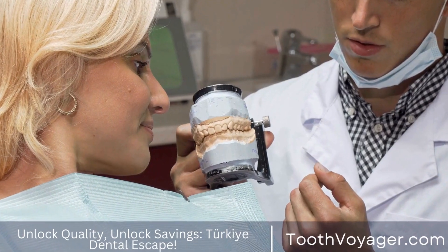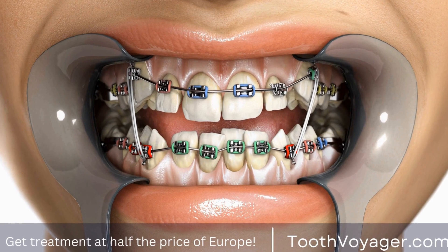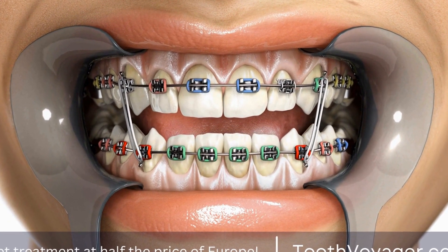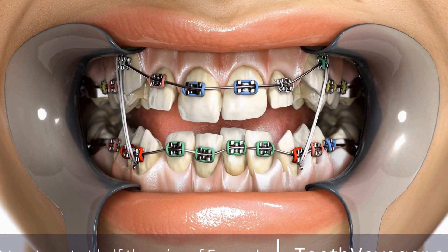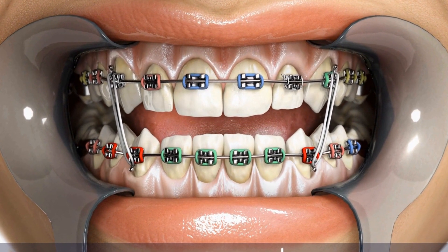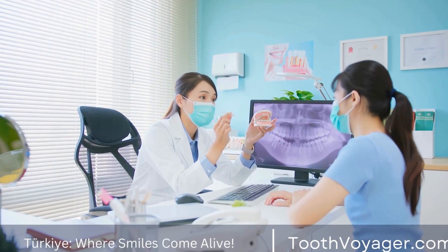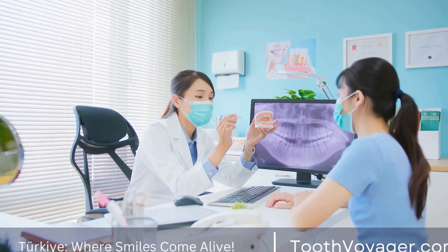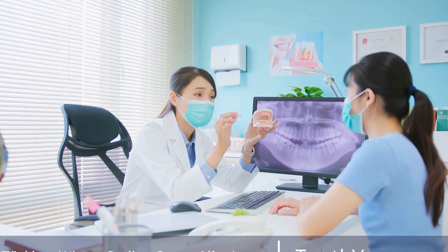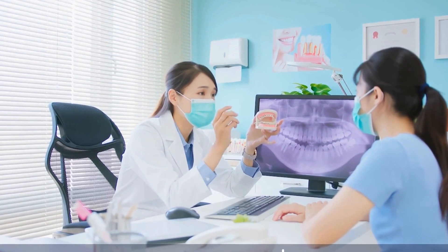What are dental x-rays? Dental x-rays, also known as radiographs, are images of the teeth, bones, and surrounding tissues that are taken using x-ray technology. These images provide a detailed view of the structures inside the mouth, allowing dentists to identify a wide range of dental problems that may not be visible to the naked eye.